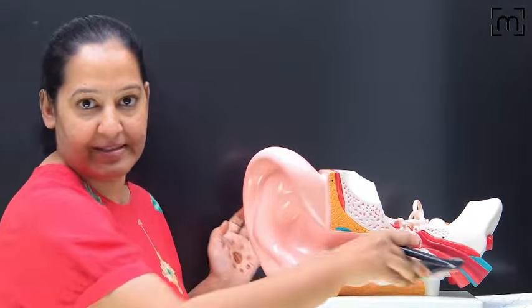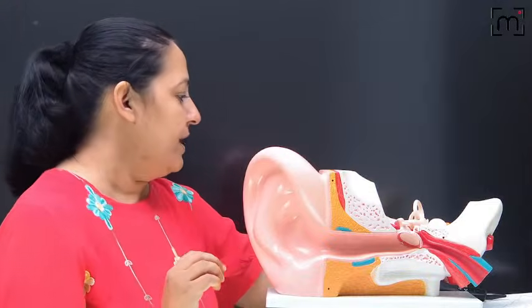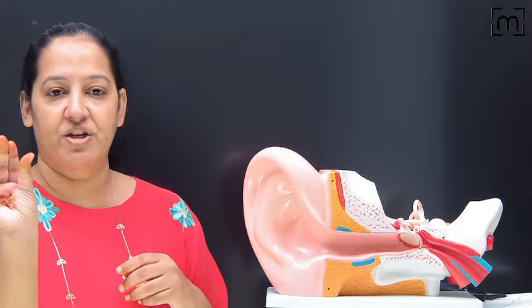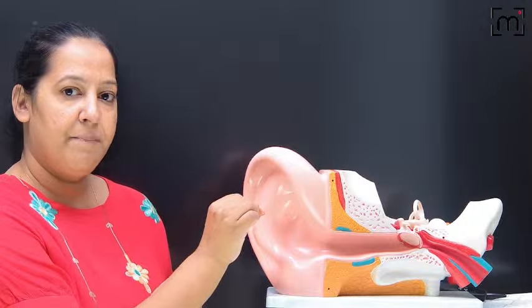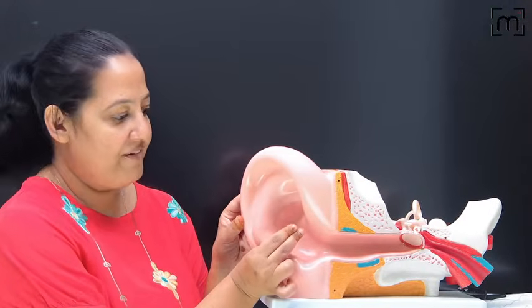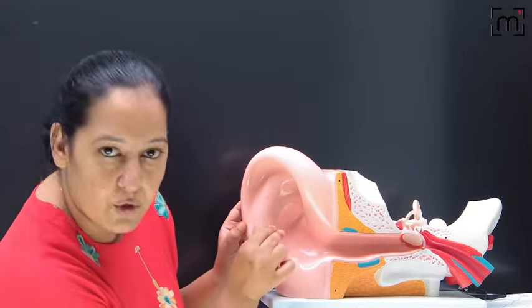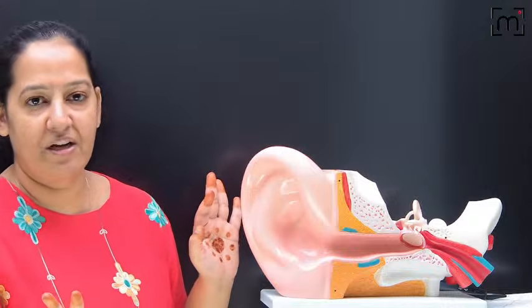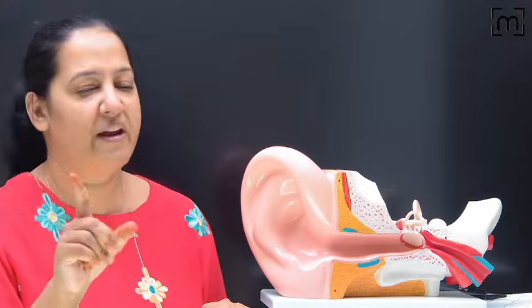So it will be like this. Suppose this is my patient's ear. The patient is complaining of deafness, whether partial or complete, some sort of deafness. I am the examiner. The first test I will perform is finger friction. This is my finger, this is my thumb, I am rubbing them against each other, I can hear the sound. Whether my patient can hear the sound, there is no particular distance. I will keep it close to the ear and ask the patient whether they can hear it, yes or no. That's the only thing, but it's obsolete nowadays. It's a screening test, a quick, rough test. There is no standardization. That was the finger friction test.